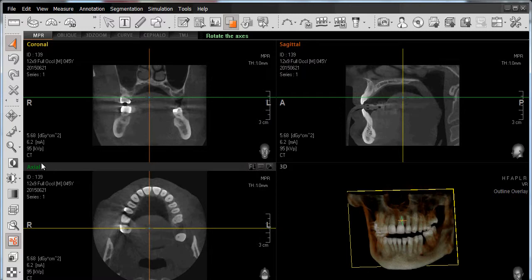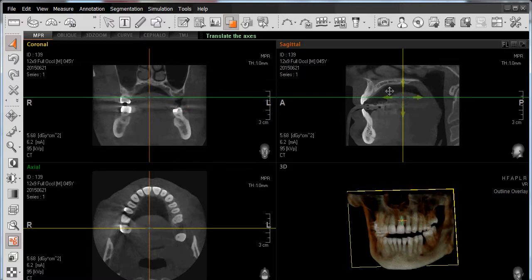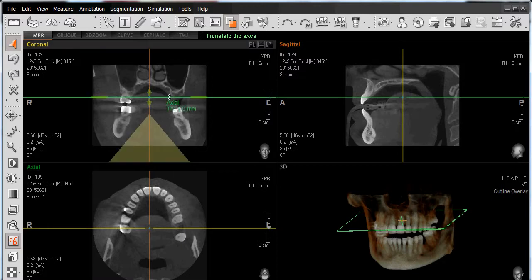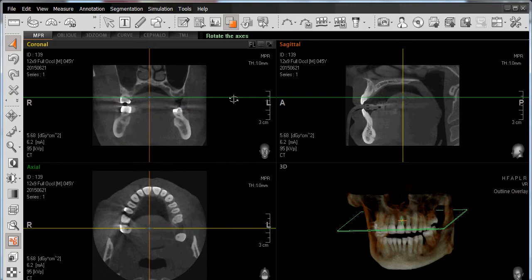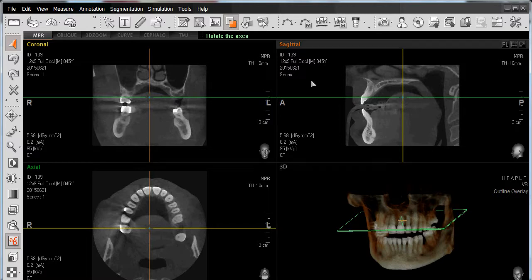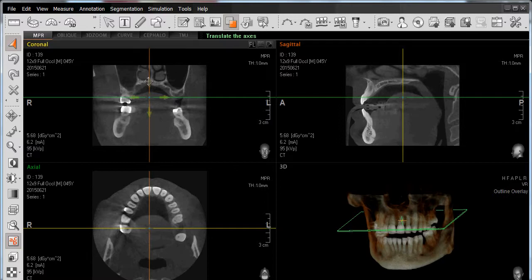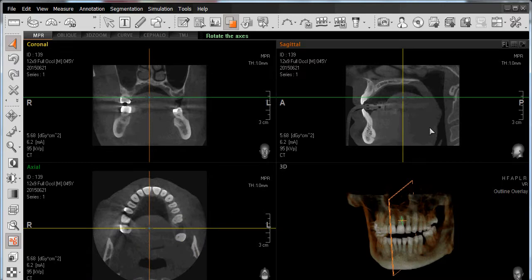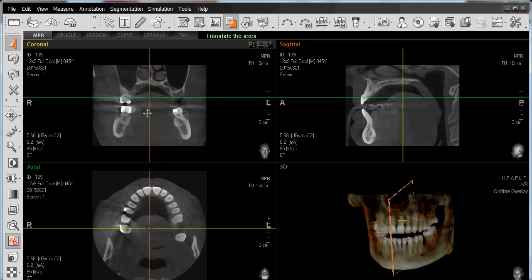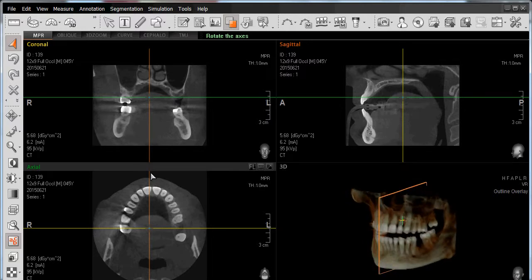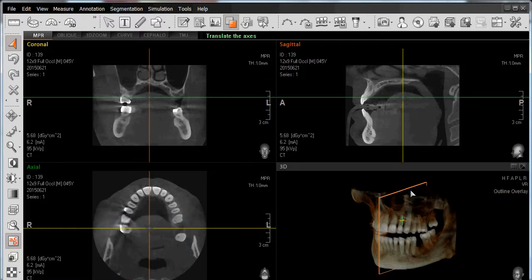Moving on to our axial view, shown in green, these two axis lines create the view in our axial window. The axis line going from right to left and the line going anterior-posterior define the axial slice. Lastly, in our sagittal view, shown in orange, two axis lines create that window's view — identified by the line going superior-inferior and the line going anterior-posterior.